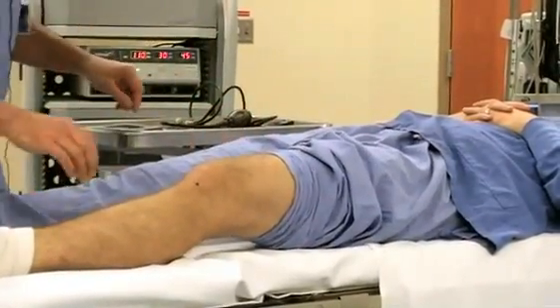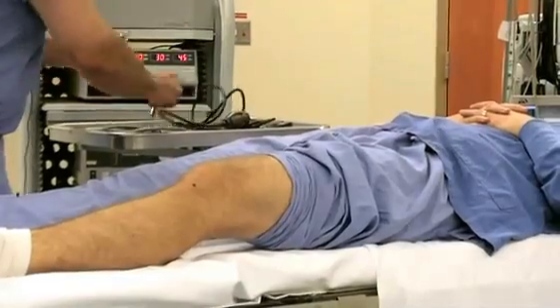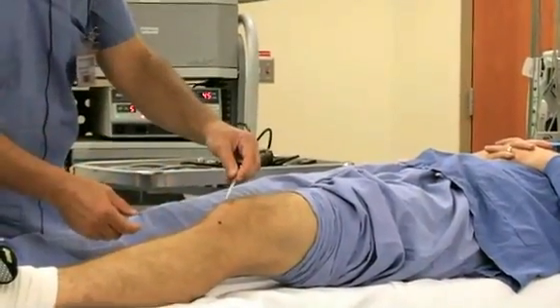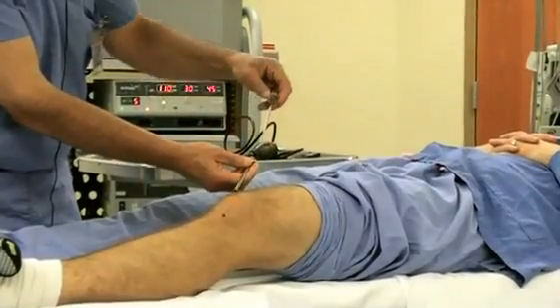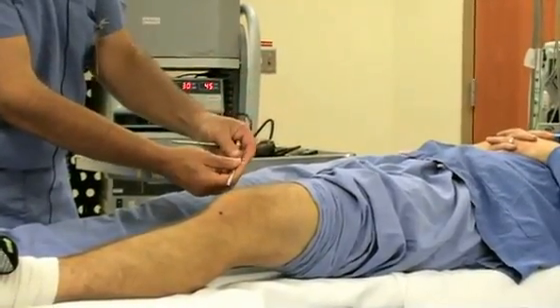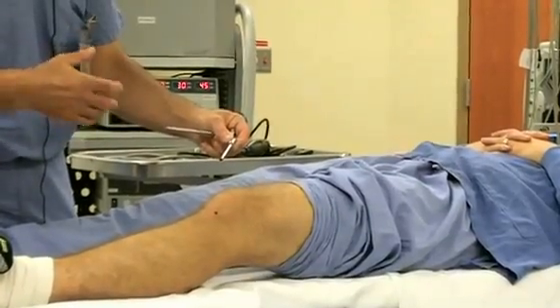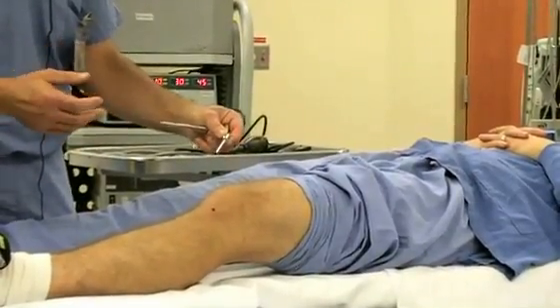This first incision is made and a small cannula that you see here is inserted into the knee joint. The blunt trocar in the middle is removed and it leaves this tube which is attached to saline which then inflates the joint to allow for better visualization and distension of the joint.